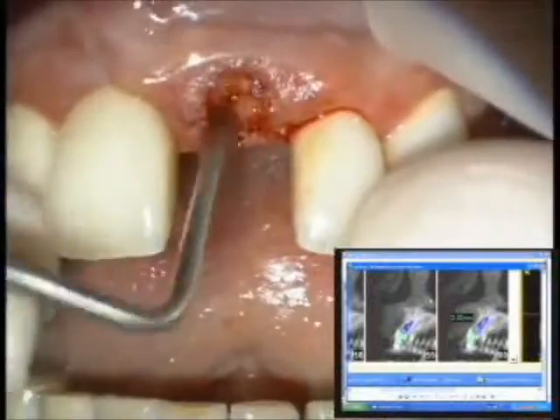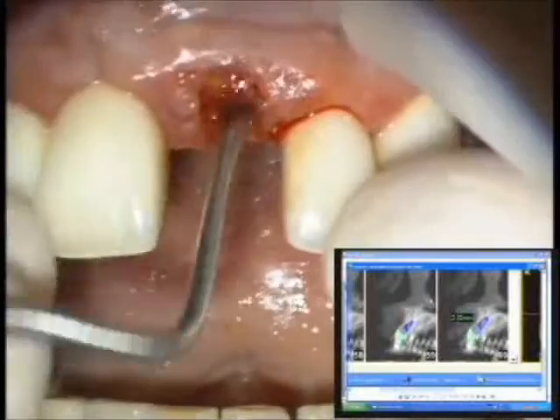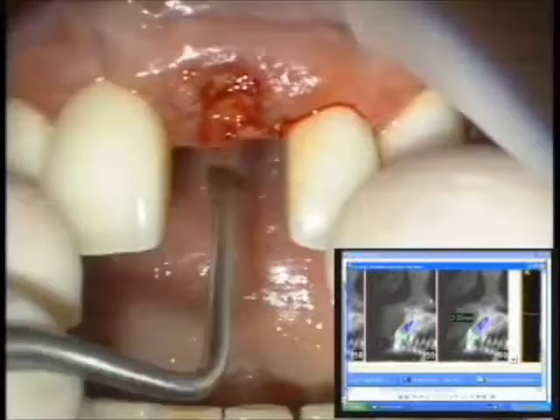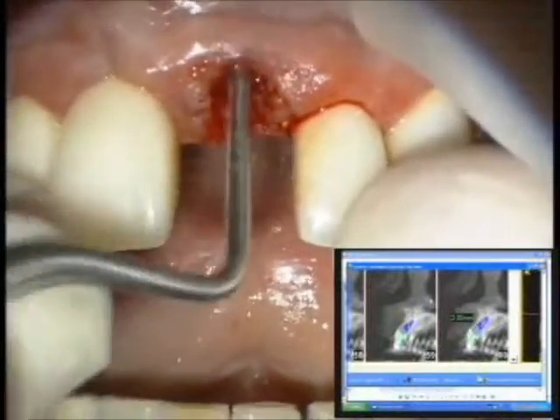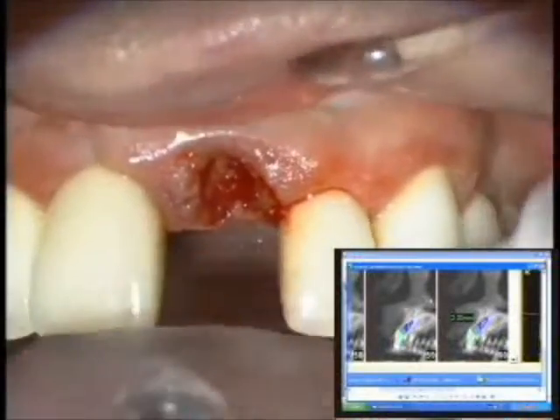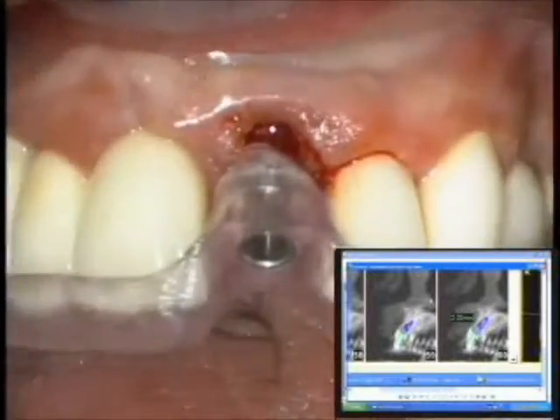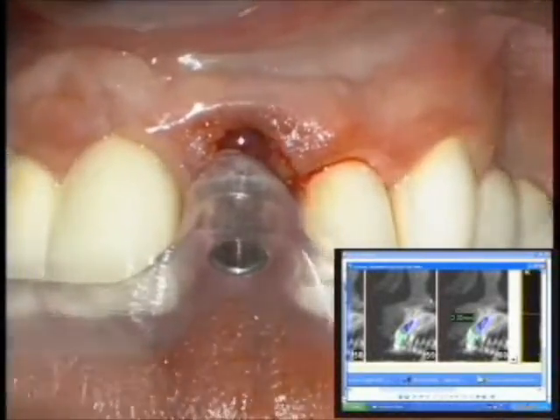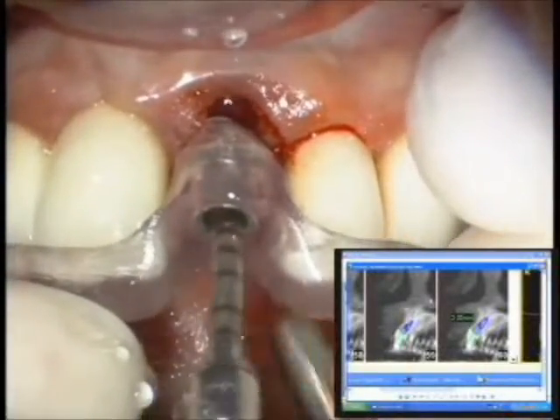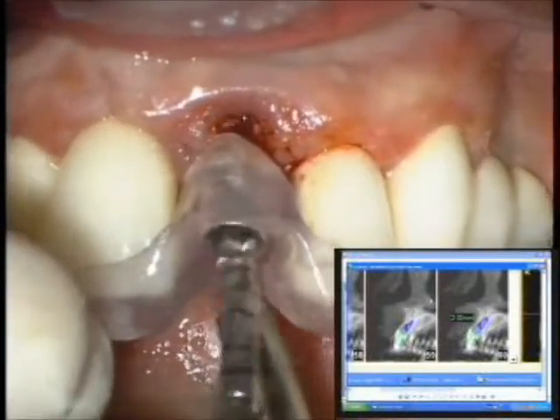Maurice, what we're doing right now is just we extracted the tooth and we're cleaning out and curetting out the defect. Okay. This patient started, that you're seeing on the left screen, this is what he came in with. Blown out case, much decay. Henry kept a few teeth for a transitional appliance, just to give you an idea of how we got to this phase. There was some soft tissue issues on the temporary, so we planned on augmenting the right side for the pontic space. This is what the patient looked like after extraction and cleanup, maintaining a few teeth for an existing bridge.